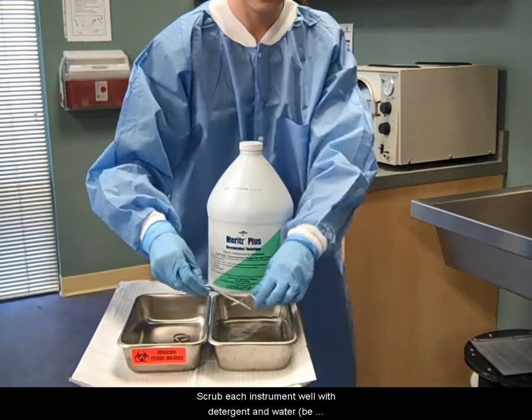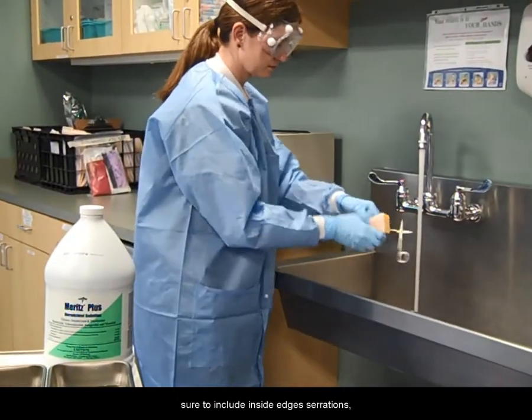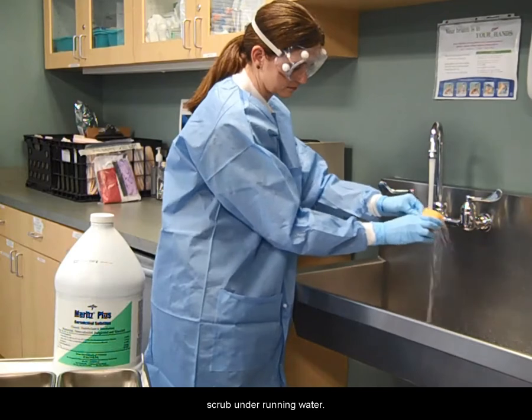Scrub each instrument well with detergent and water. Be sure to include inside edges, serrations, grooves, hinges, and all surfaces. Scrub under running water.